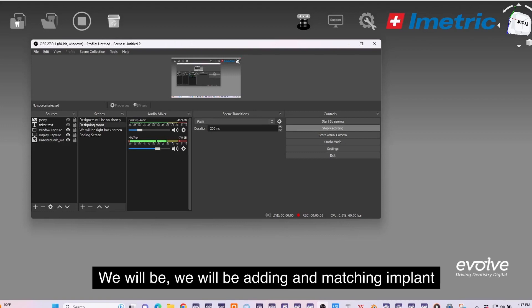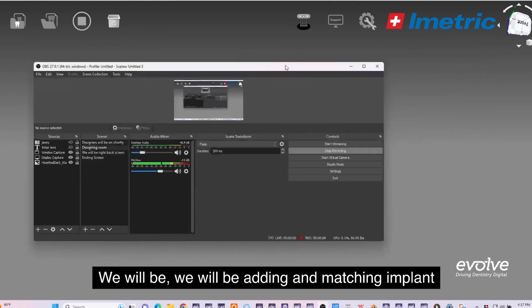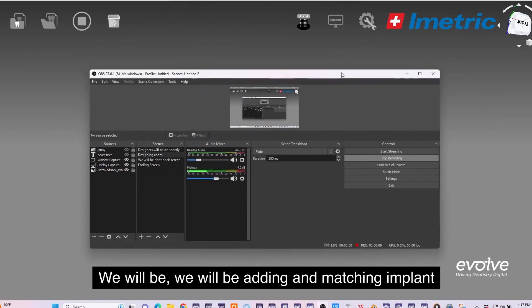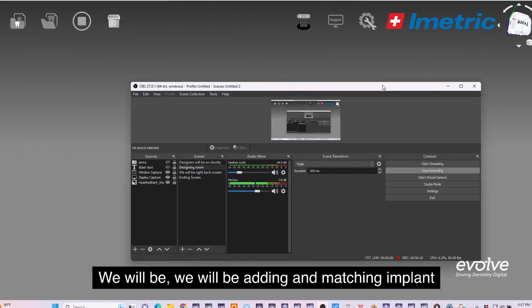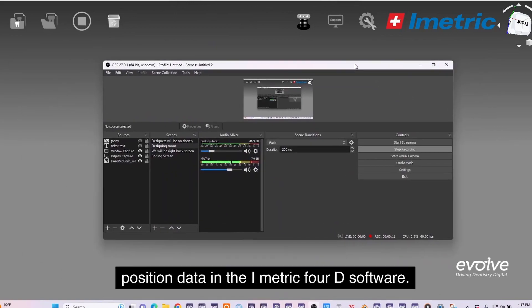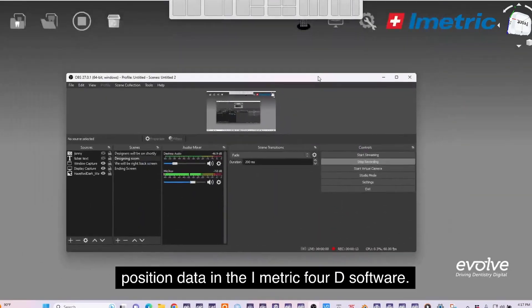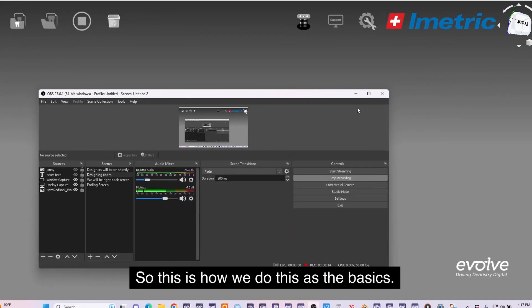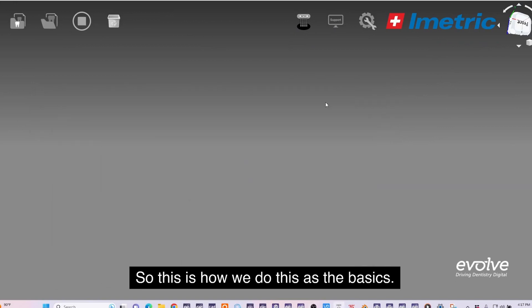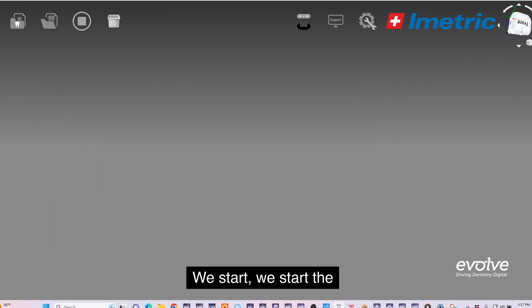We will be adding and matching implant position data in the iMetric 4D software. This is how we do this as the basics.